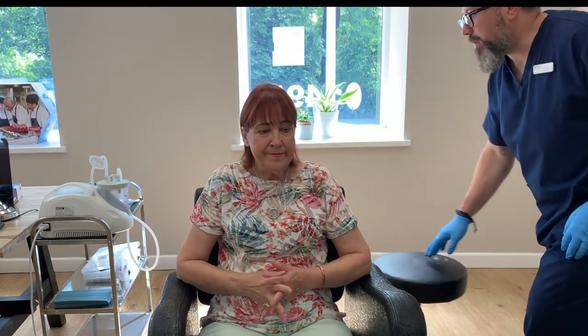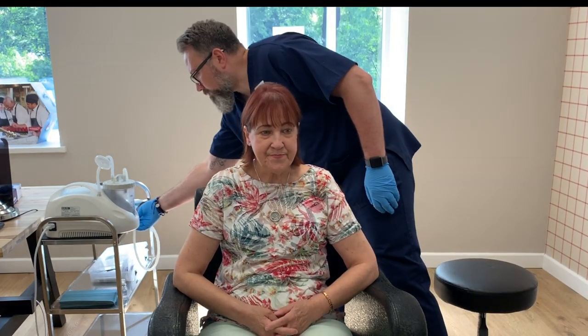Right, so what I want to do, let's start with this left side first of all. As you are there, it's perfect for me — you don't need to do anything special with your head position. If I do need you to alter your head position a bit later on, I'll let you know.